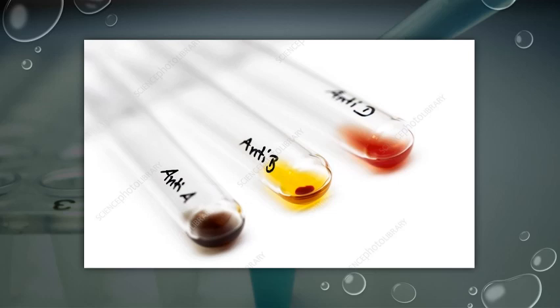Most D-positive RBCs react macroscopically with anti-D at immediate spin. This is referred to as Rh positive, which has a 3 plus or 4 plus agglutination reaction. However, there are some D-positive RBCs that do not react or agglutinate at immediate spin. That is the reason why we need to test for weak D antigen before releasing the result.